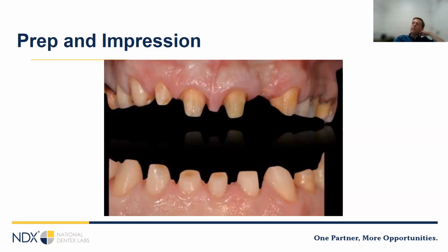If you're making some big changes, what people call rapid orthodontics, where you're prepping the teeth a lot to move the tooth position, sometimes it's nice to have a clear shell from the mock-ups, and you can poke little holes in it and then measure your reduction with a perio probe. Make sure that you've reduced enough all the way around. If you align the anterior preps more, especially when you're doing all ceramic restorations, you'll get a better result.